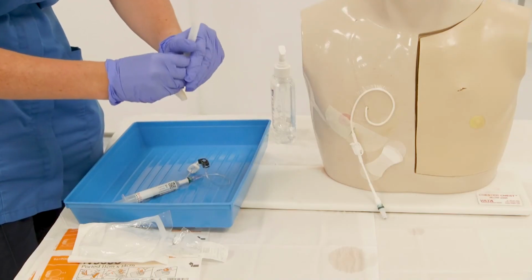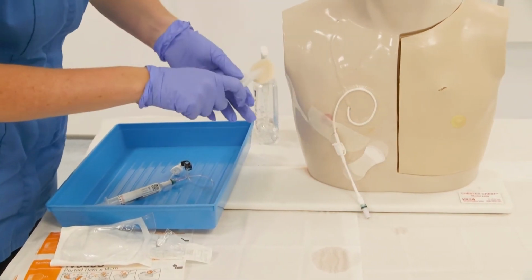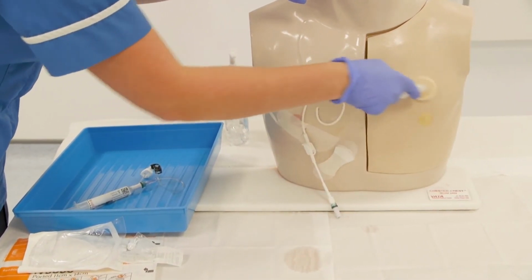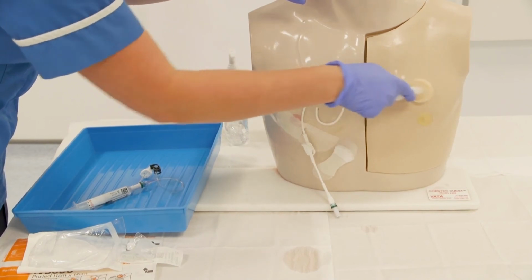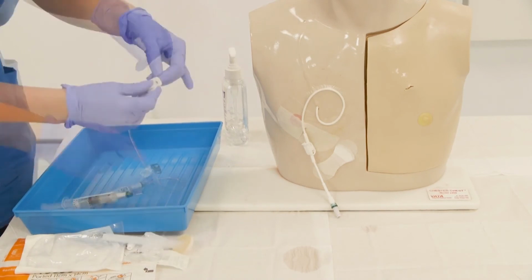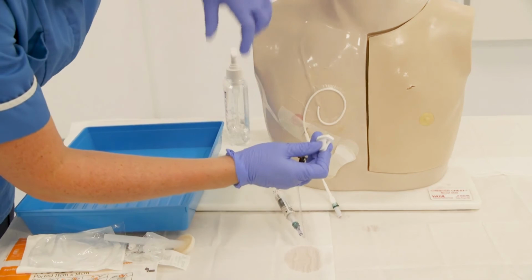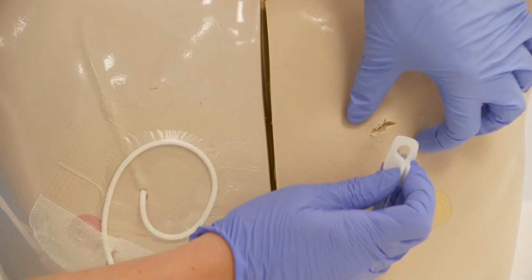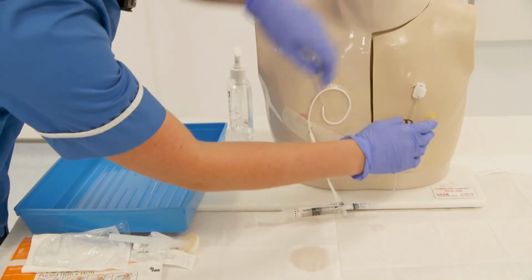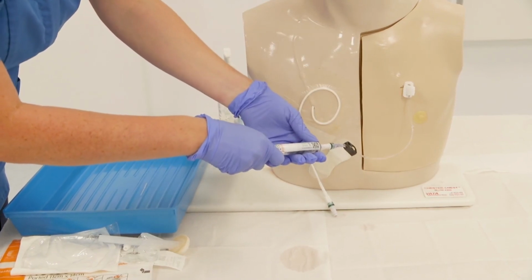Once you know where the port is, using a ChloraPrep wand or stick, clean over the site in a crosswise motion for 30 seconds. And then once you have done that, leave it to dry for 30 seconds. Take the covering off your needle, and then without touching the area that you're going to go into, place the needle into the port. Unclamp your line, flush your line with saline and check that it bleeds back before you do anything else with your line.